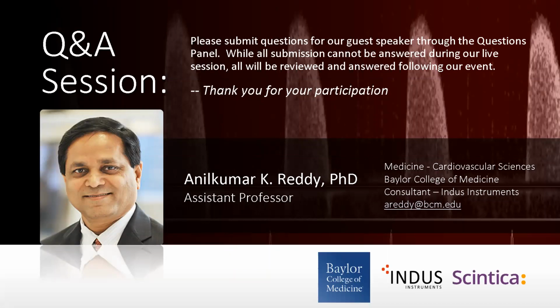That makes complete sense. Another researcher or attendee asks, have you measured descending aortic velocity? Yes, you can measure. I specifically did not measure except to show that you can measure, but the key thing in trying to measure descending aortic velocity is to know your anatomy and see where you are placing the probe.